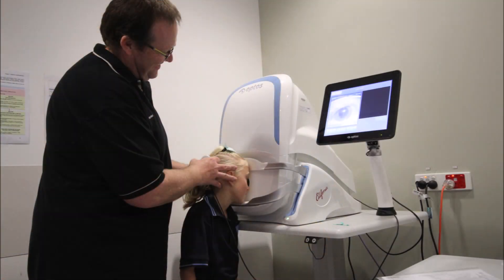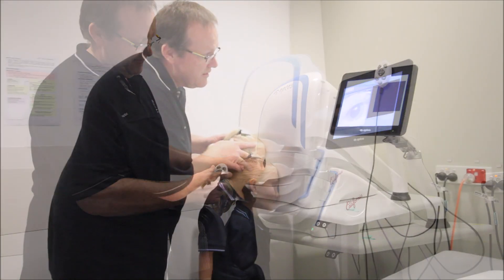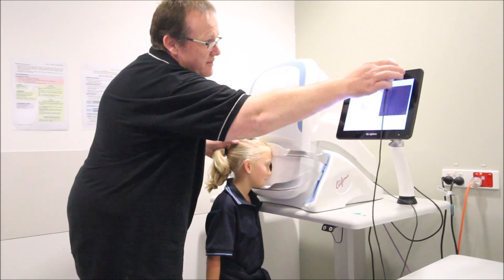Older children can be imaged whilst standing, sitting, or kneeling. Instruct the child to look into the camera's aperture and guide the head whilst taking photos.